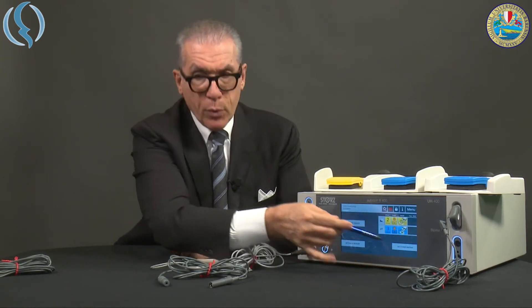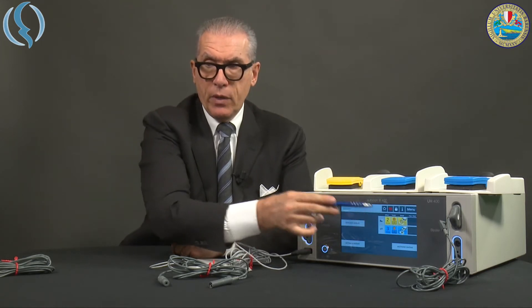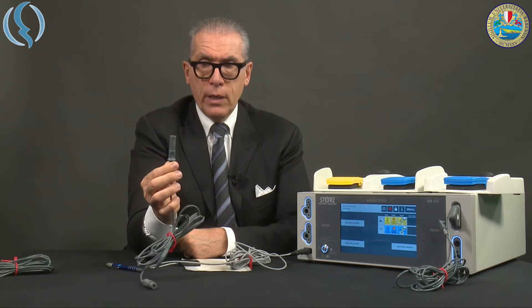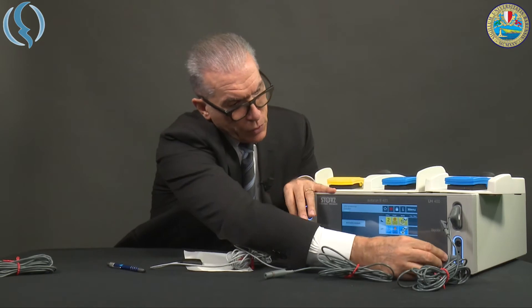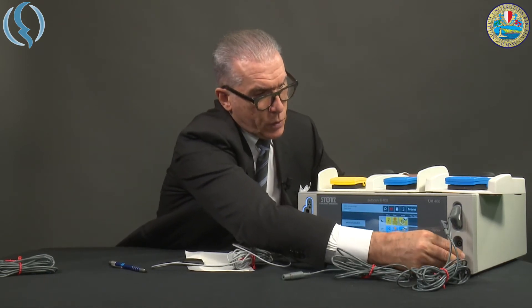You give the approval and you go directly into the specific mode. Then we have the general-purpose bipolar cable that is inserted in the dedicated socket here.